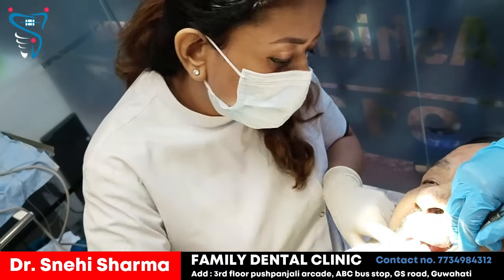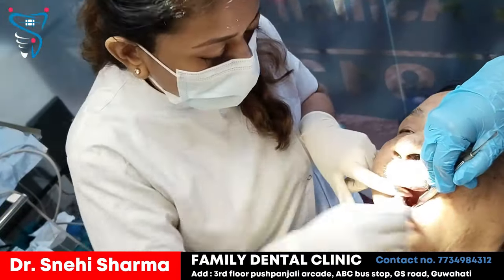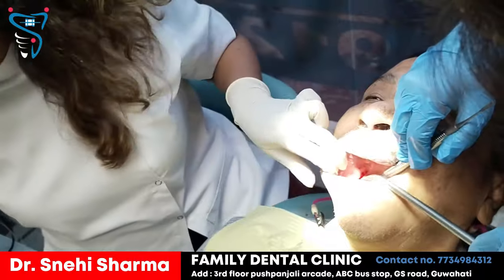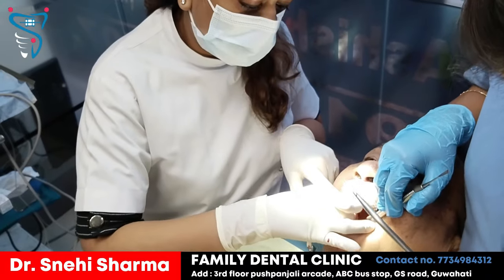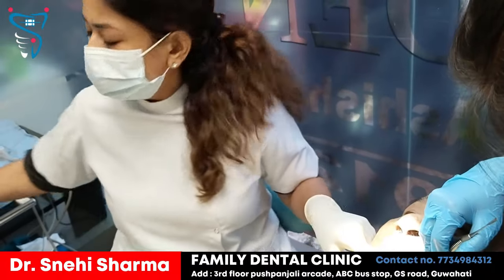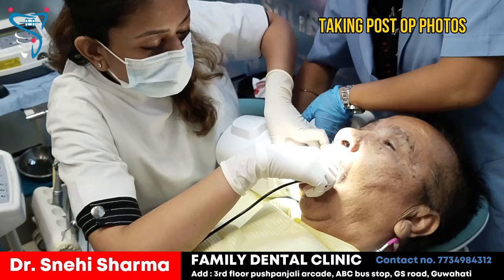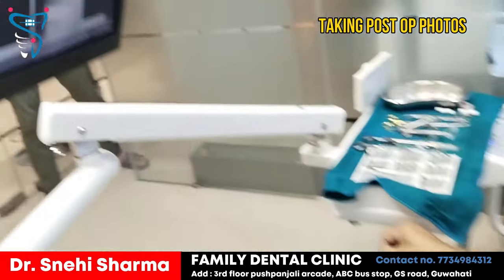Now we're going for the second implant. You can see we've placed both the implants.